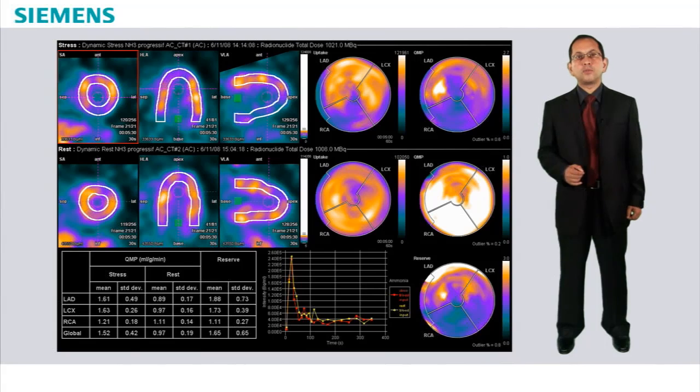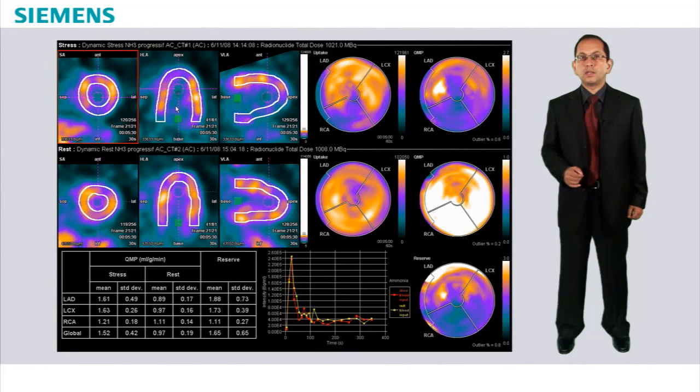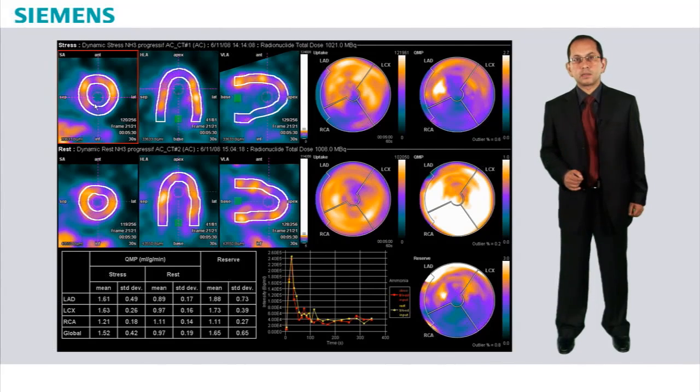Myocardial blood flow quantification is shown here in a patient with suspected coronary artery disease. Here we see the display of the dynamic perfusion study with the short axis view, the horizontal long axis view, and the vertical long axis, both at stress and at rest. There is an inferior wall perfusion defect at stress which shows improvement in uptake in the resting study.